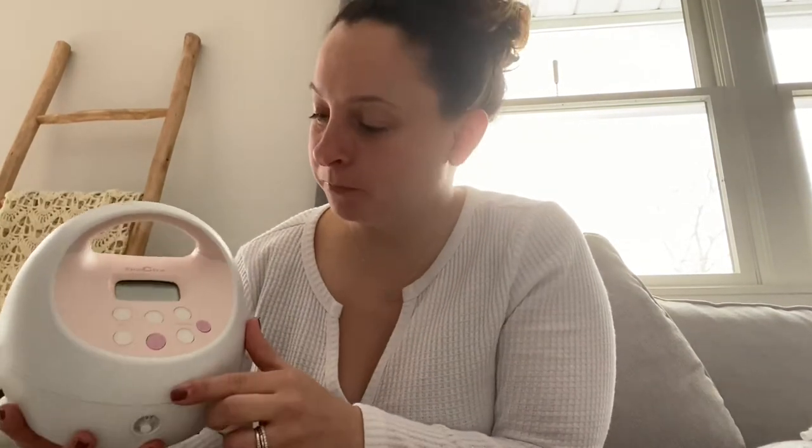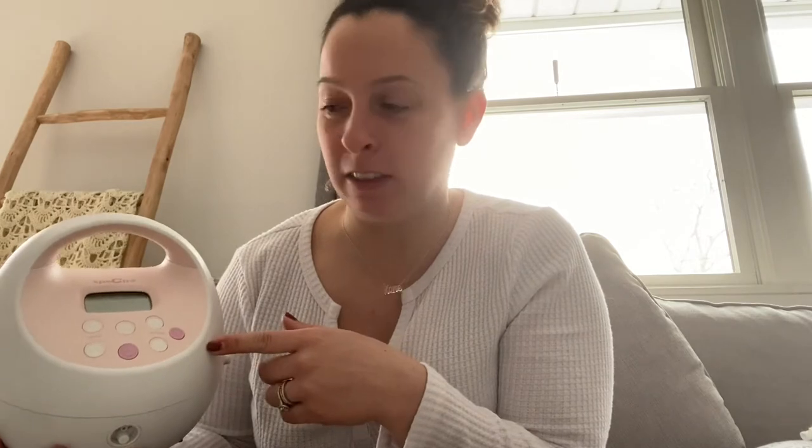Here's pumping with Kristin. Here is your Spectra pump. I'm going to go through all the settings with you that the lactation consultant went through with me. This is the light, which I always use because it's kind of hard to see the screen sometimes, and here is your power button.